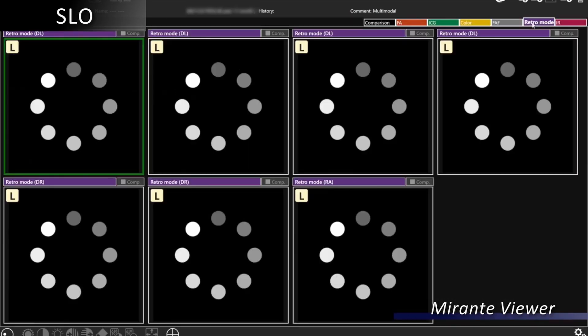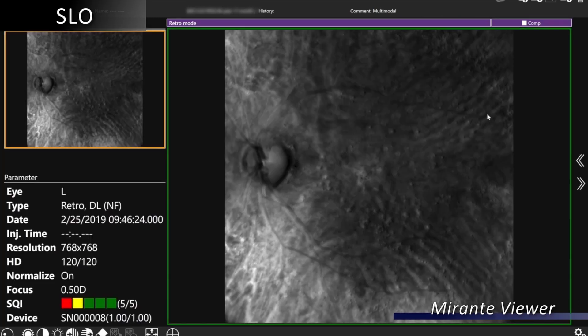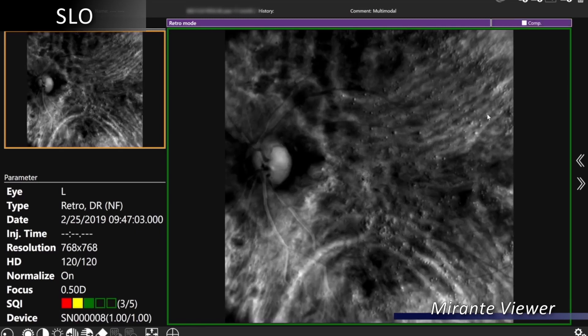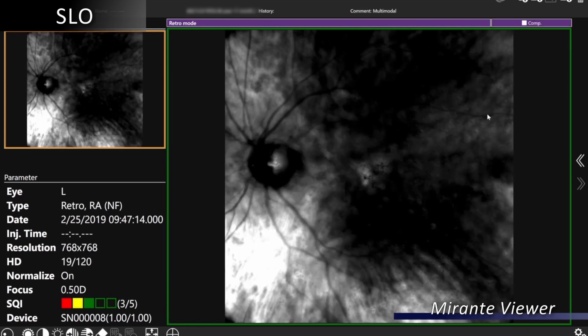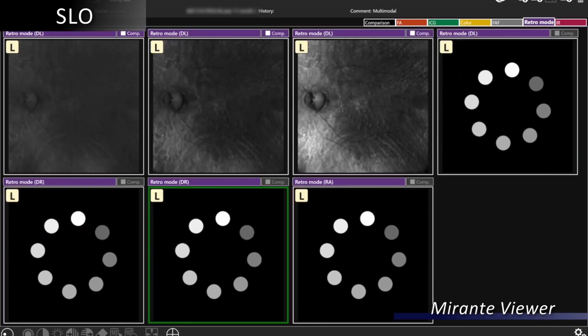In our unique retro illumination mode that provides pseudo 3D imaging, we have three apertures: dark left, dark right, and our ring aperture, which will give us a different approach to imaging.